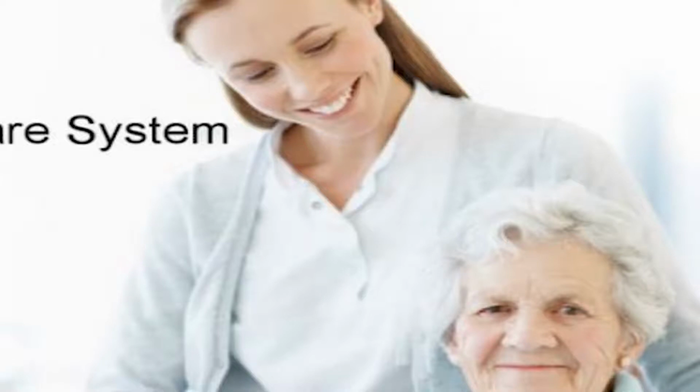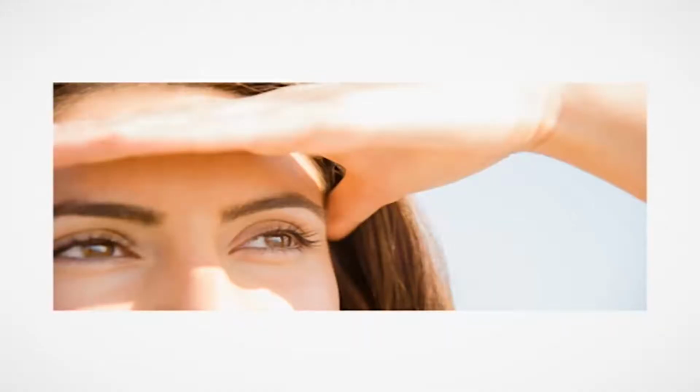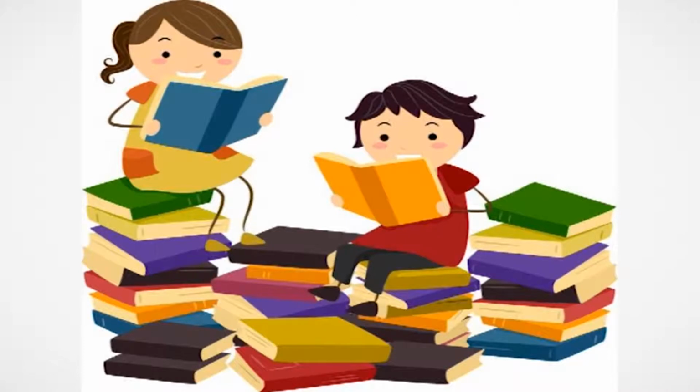Spectacle magnifiers have stronger and high-powered lenses compared to the usual eyeglasses and are designed for close work. The powers range up to plus 24 diopters. Spectacle magnifiers are used for tasks such as long-term reading, writing, needlework, making invoices, and receipts. They are usually monocular with the weaker eye blanked out. The person using them needs to hold the reading material very close to their eyes in order to keep the print in focus. One needs some practice to get used to these spectacles.